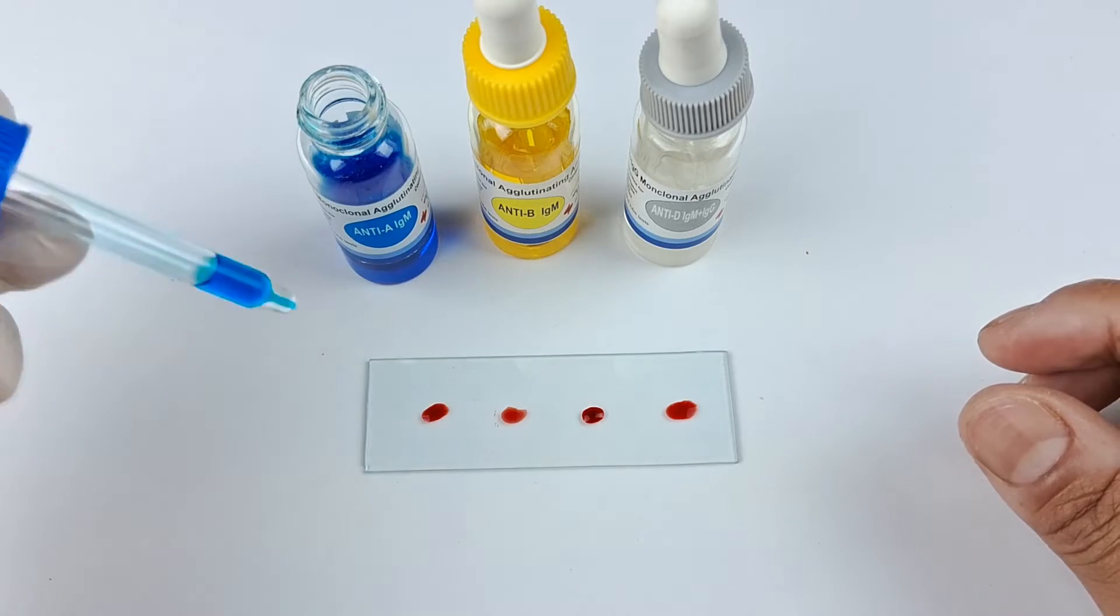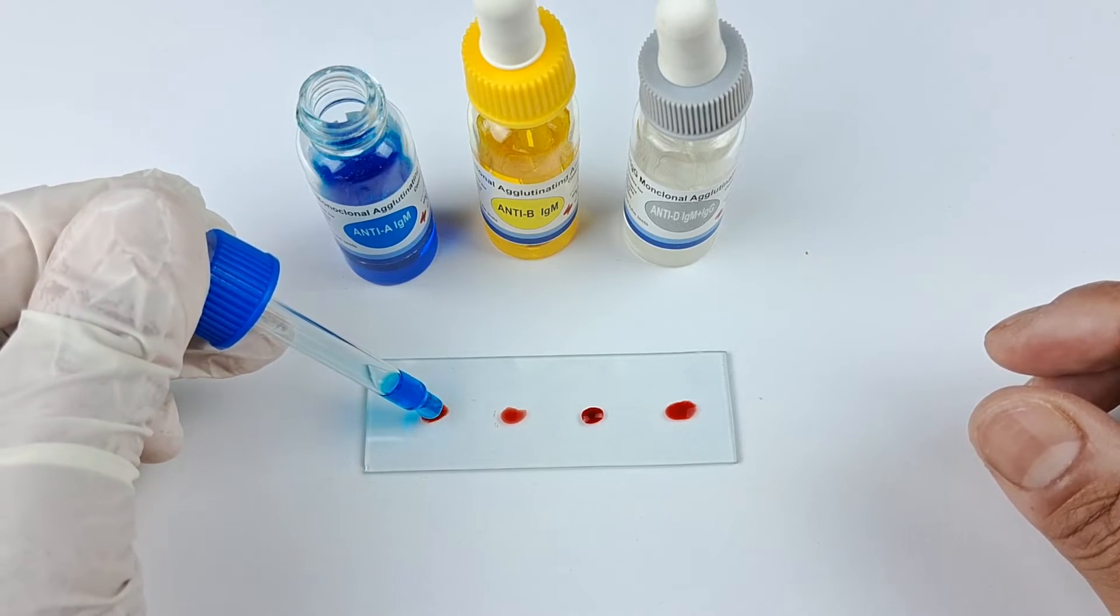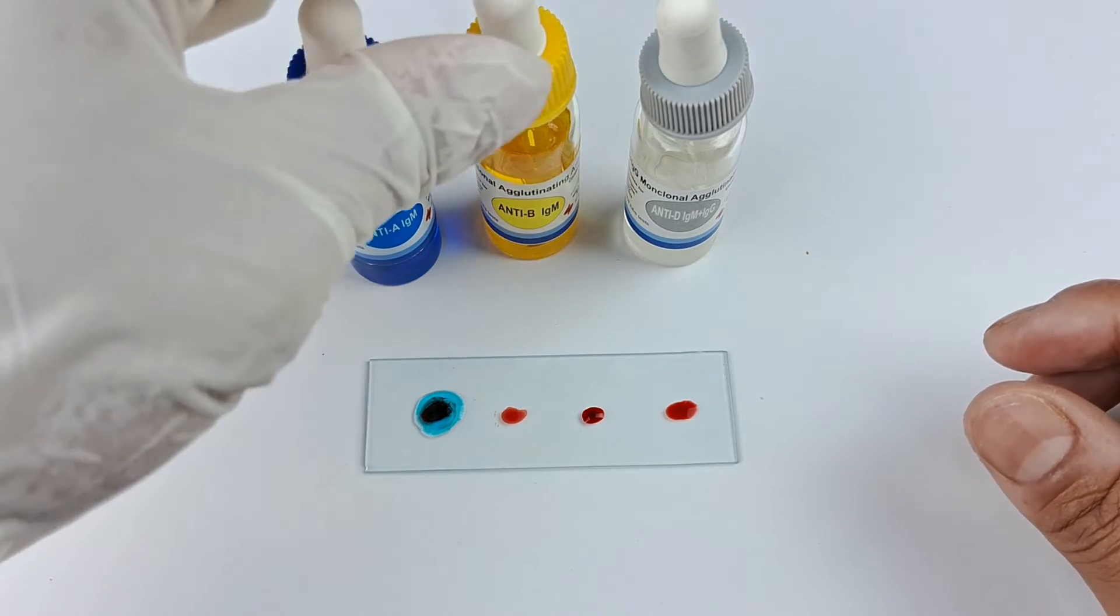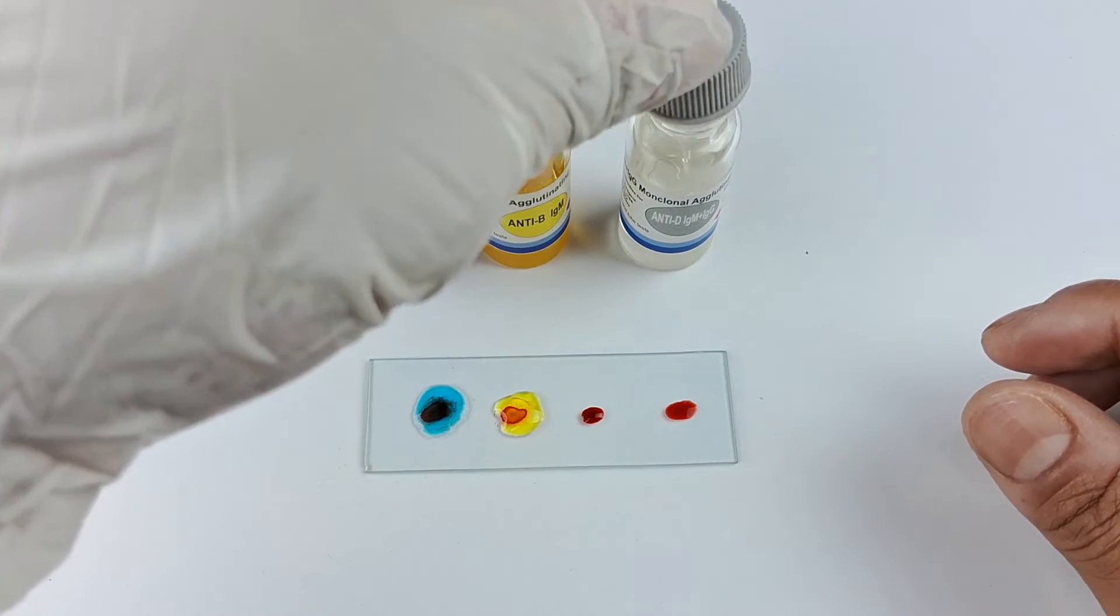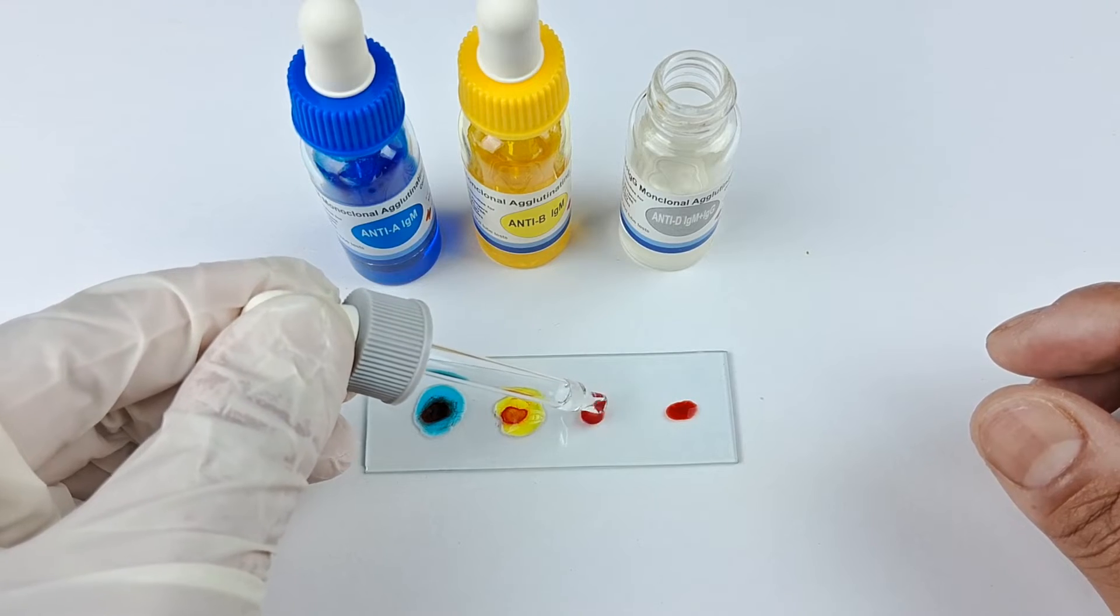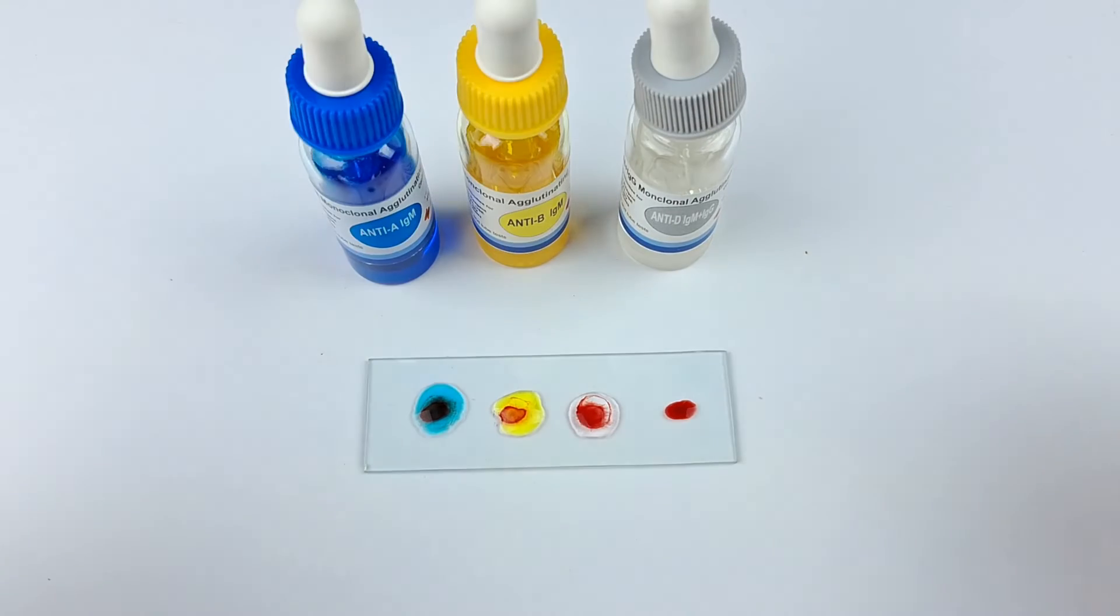Then open the vials and place one drop each of the antisera A, antisera B, and antisera D reagents in quick succession to the first, second and third drops of blood respectively. To the fourth blood drop, which is the negative control, add nothing else but a drop of normal saline.